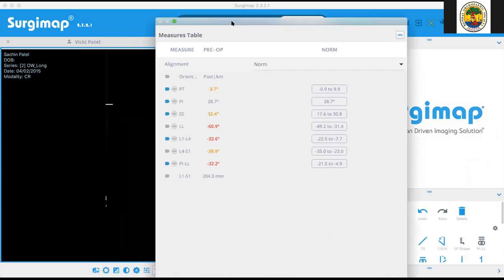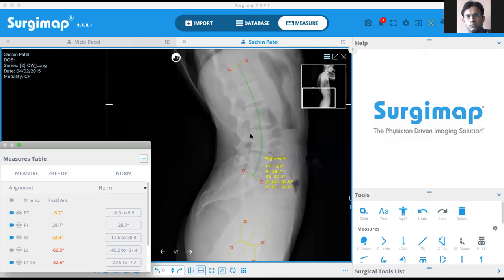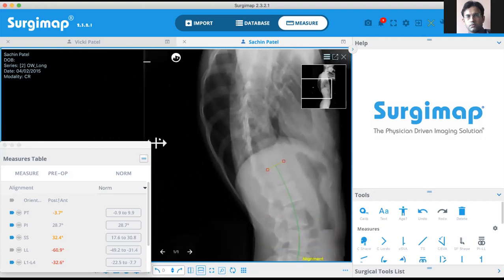Double click the side, the two lines. All right, what's next? Kyphosis. Is anything remaining? I think we are done. Kyphosis is there, but that will be the same as the angle measurement. It will be like a curve angle measurement, or your angle measurement for that matter.